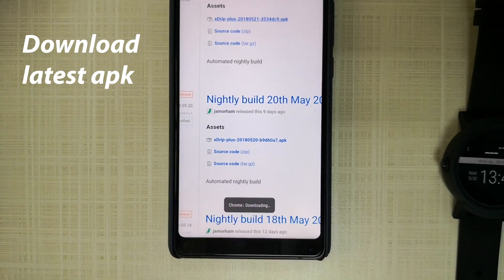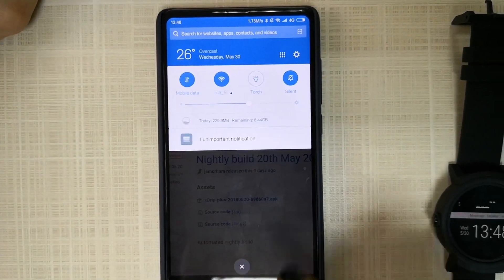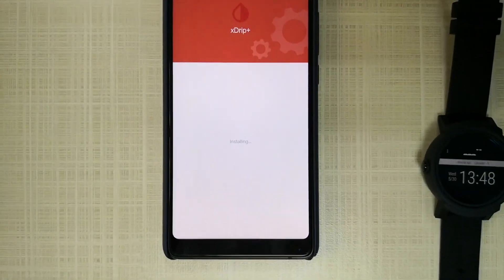Accept the download in Chrome. Once it's downloaded, open up the xDrip Plus APK and press install.